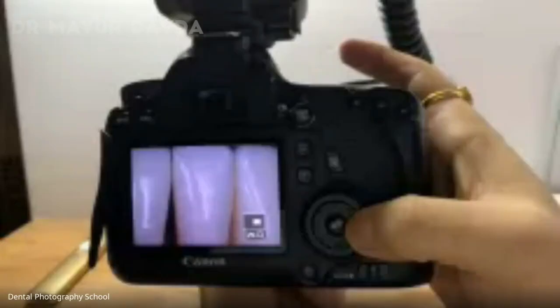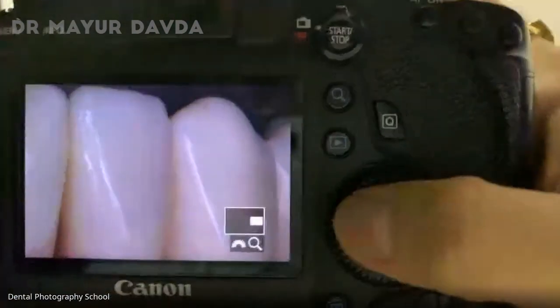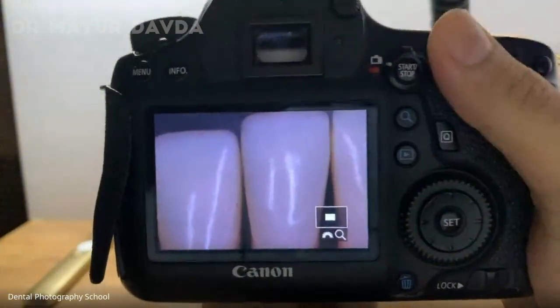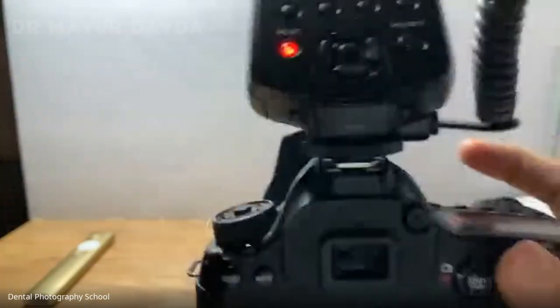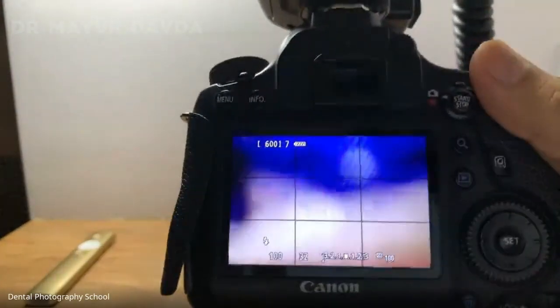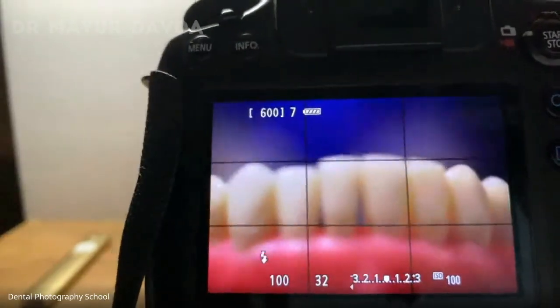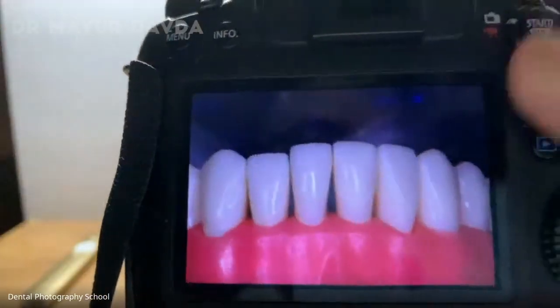You can see that everything is really sharp. You don't worry about sharpness at all, and it hardly takes any time to take an image. Let me show it to you again. This time I'm going to do it super fast. I'm just going to go ahead, just going to come behind. As soon as it's a little sharp, I'm going to take the shot.